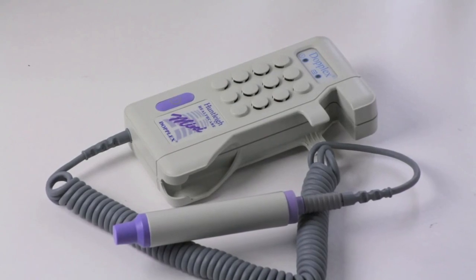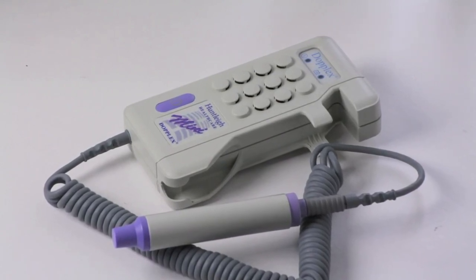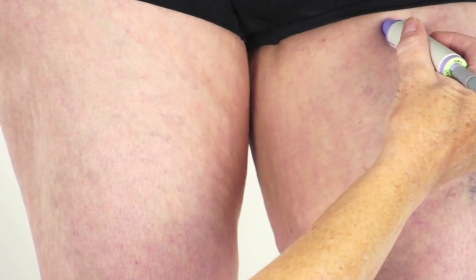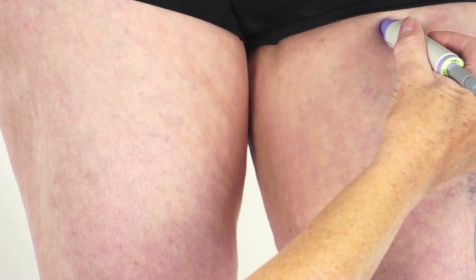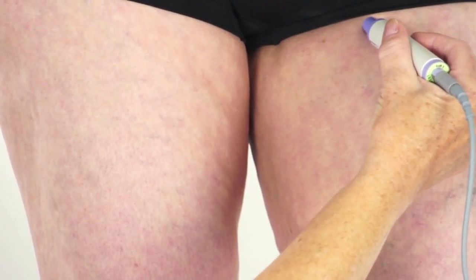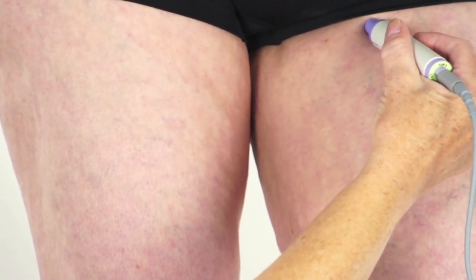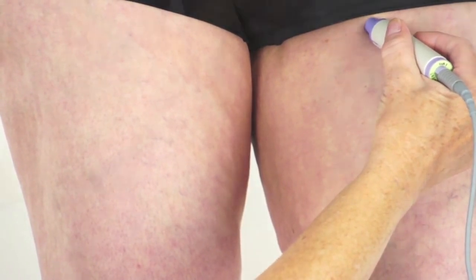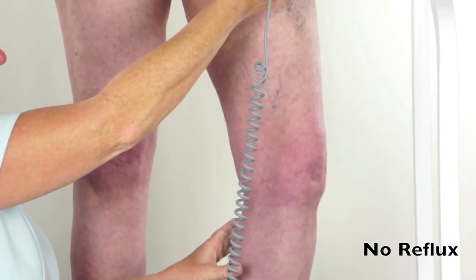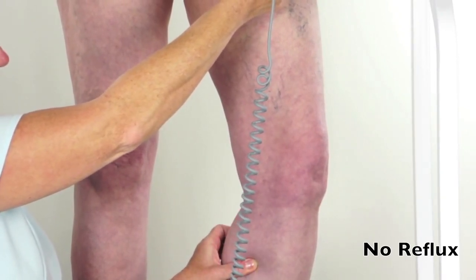I use a Huntley Doppler with an 8 MHz probe. Listening over the midpoint of the inguinal region, you can hear the pulsations of the femoral artery. As the probe is moved slowly, it will pick up the signals of the saphenofemoral junction and the great saphenous vein.